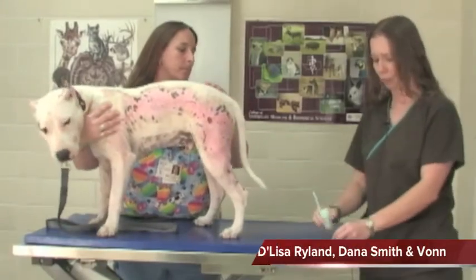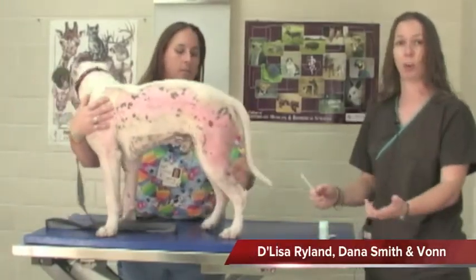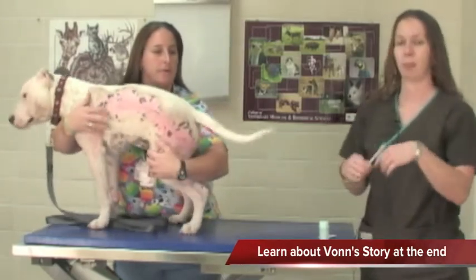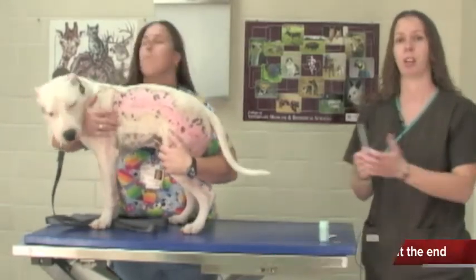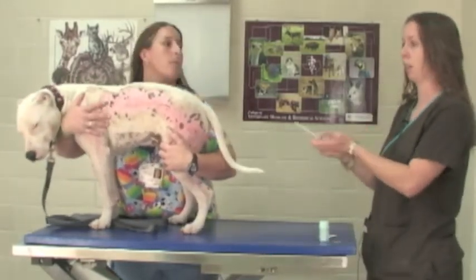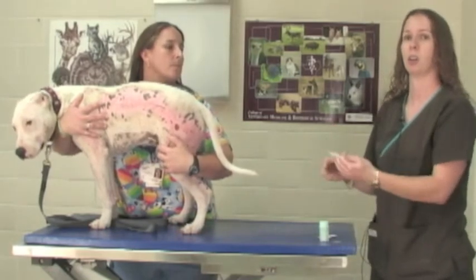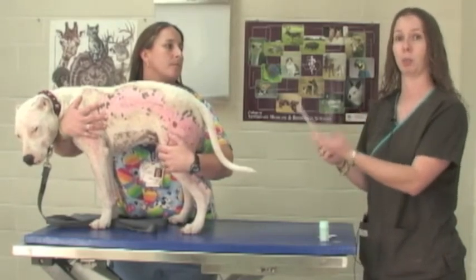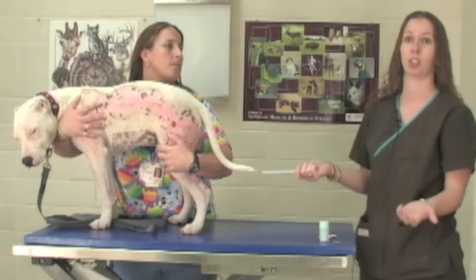First we're going to talk about collecting a fecal sample. Collecting a fecal sample is very important in maintaining the health of our patient because many of the parasites that attack our patients attack the intestines. If we are able to obtain a fecal sample, we are able to identify those intestinal parasites and then treat them.